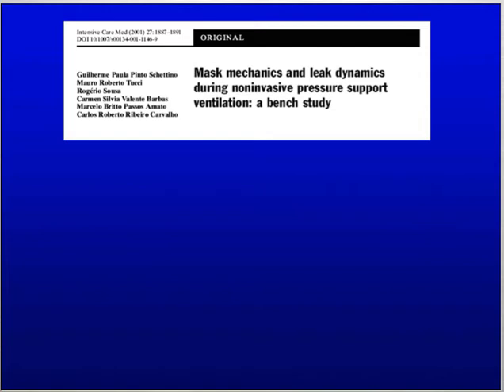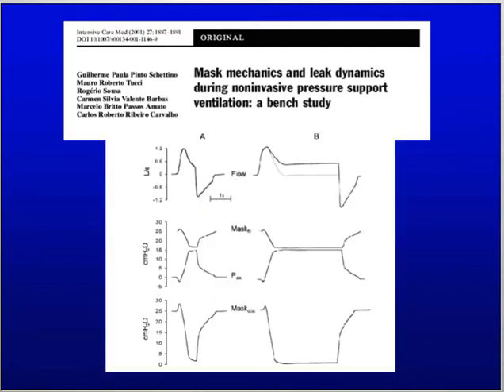It was very interestingly studied by a study from Brazil, published in Intensive Care Medicine, looking at the mask mechanics and the leak dynamics during non-invasive ventilation in a bench study. They measured at the same time the pressure in the mask, so the airway pressure for the patient, and the pressure within the cuff, the cushion of the mask.